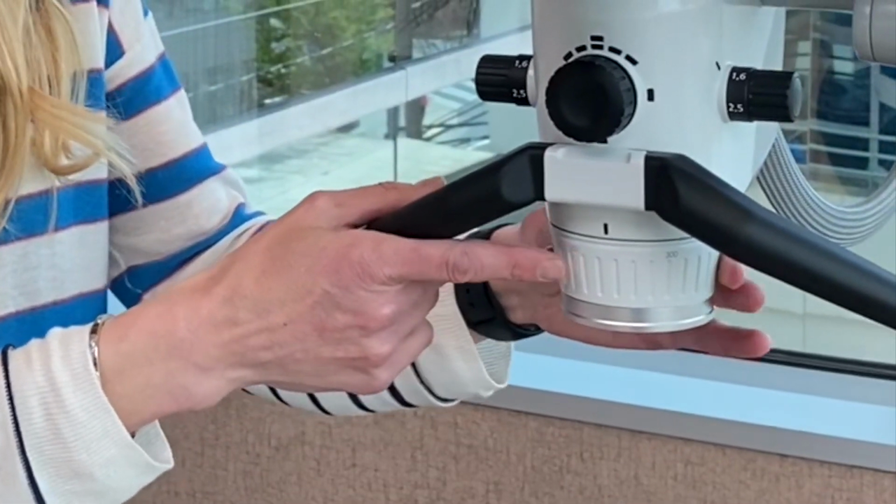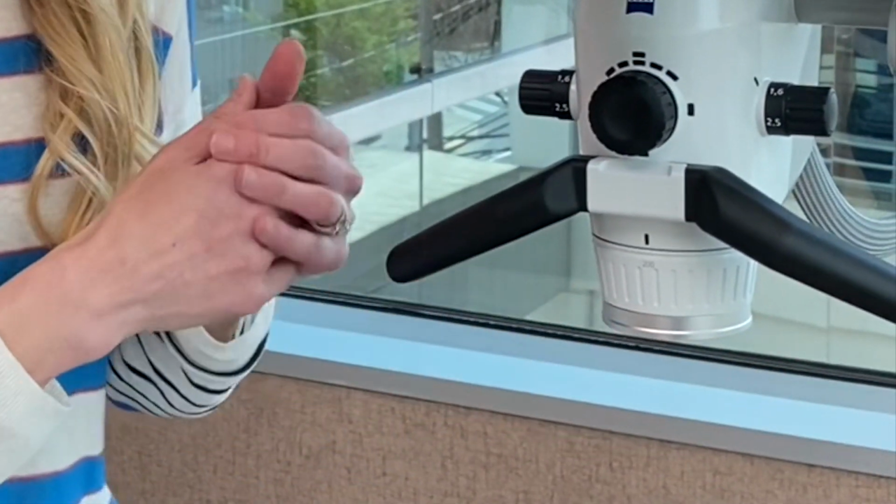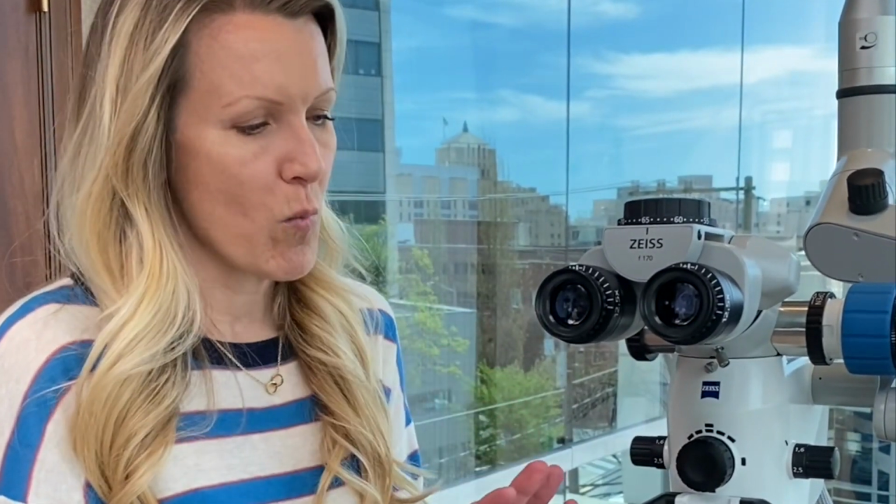Another thing that this is really great for is that it is also a fine focus. As you go to higher magnifications, one thing that you notice is that your depth of field really shrinks. At the highest magnification, you may only be able to see 5-6 millimeters in terms of depth, whereas at a lower magnification, you may have 18 millimeters of depth. So if I'm working in a patient's mouth and I need to see, let's think of the facial surface on number 8, and I want to see the palatal surface on number 8, this would be a really quick, easy adjustment. I would just dial my focal length back a little bit and be able to see the palatal side of the tooth without having to move the whole camera body and the scope around. So it's just a really handy, quick adjustment that you can make.